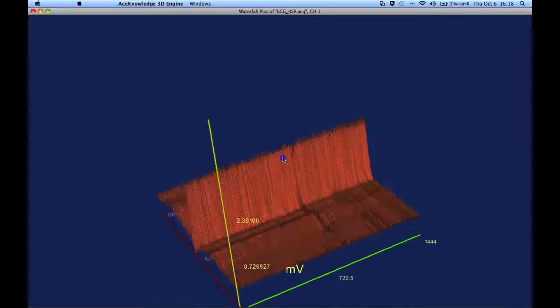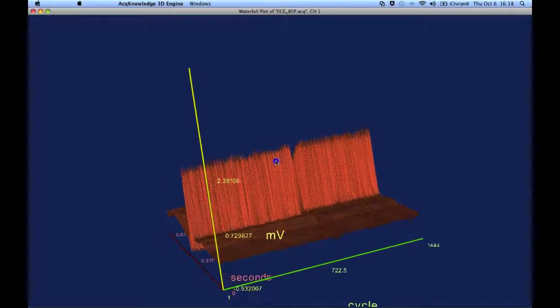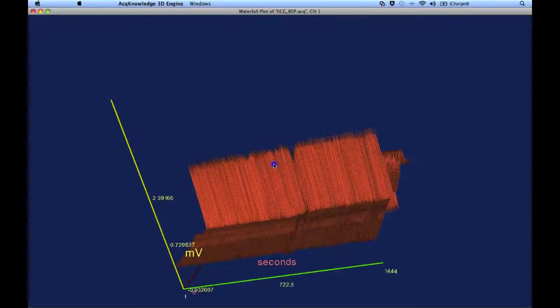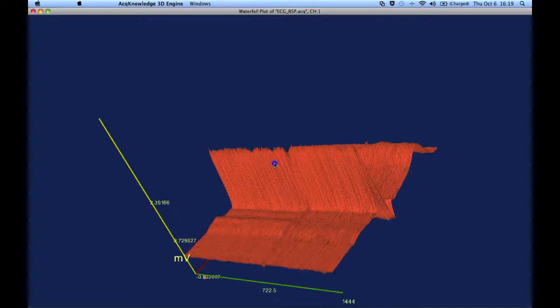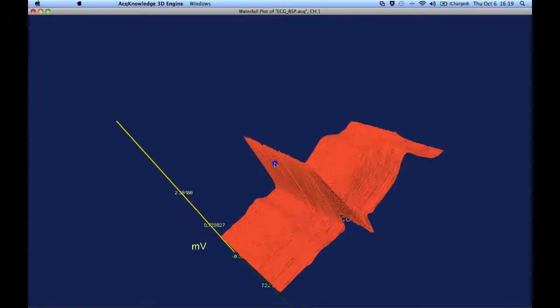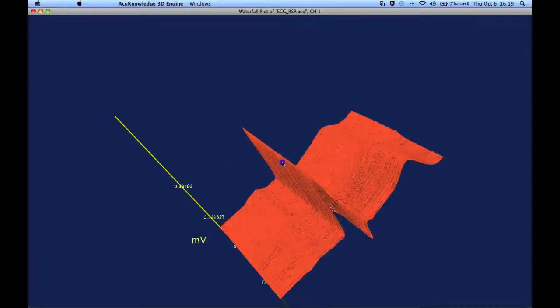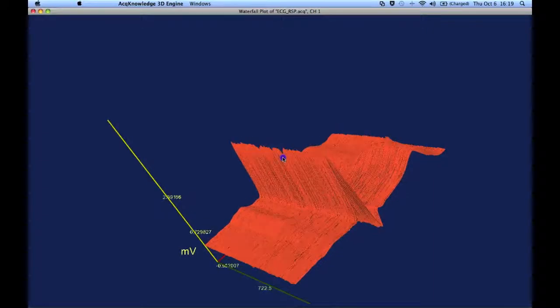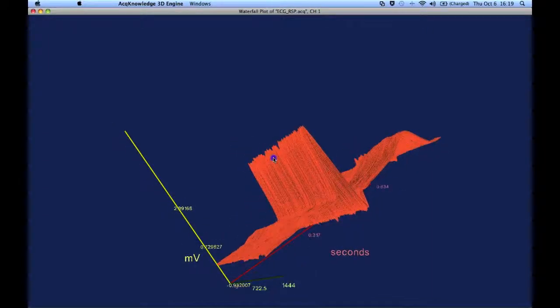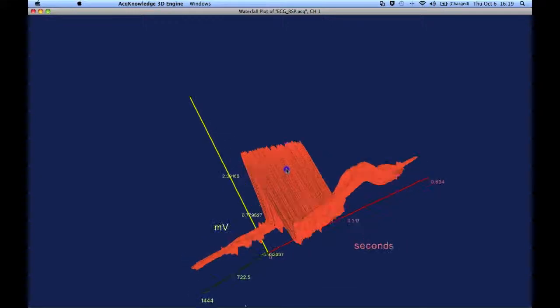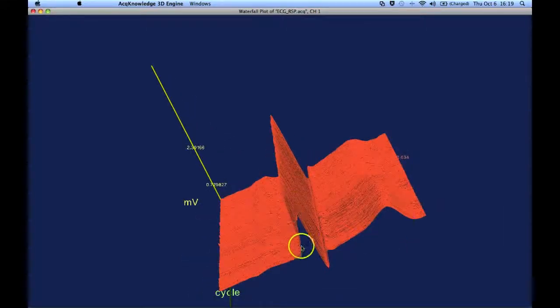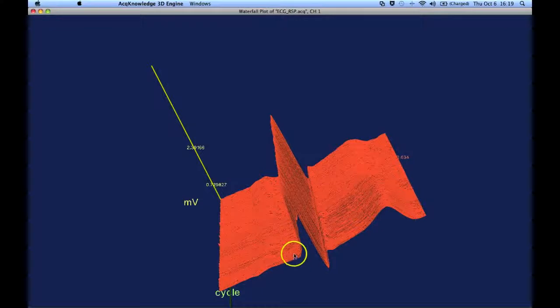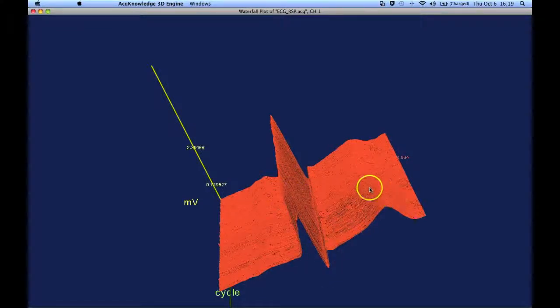And then you can see some changes, some variation part way through. Keep rotating around. So there's the P wave, QRS, and then there's the T wave.